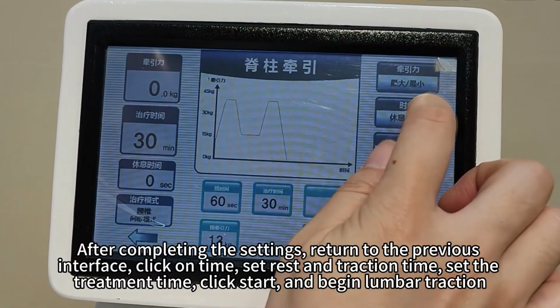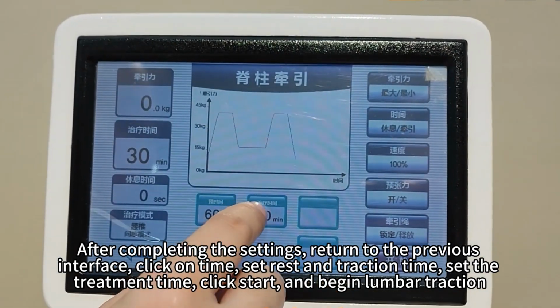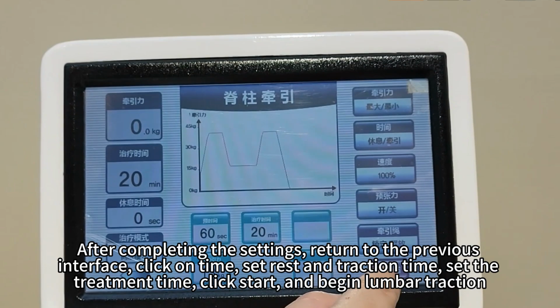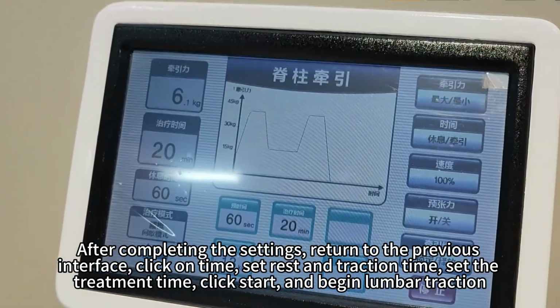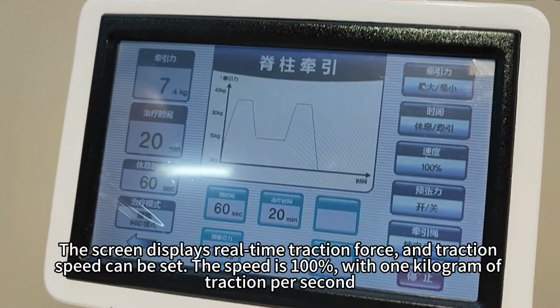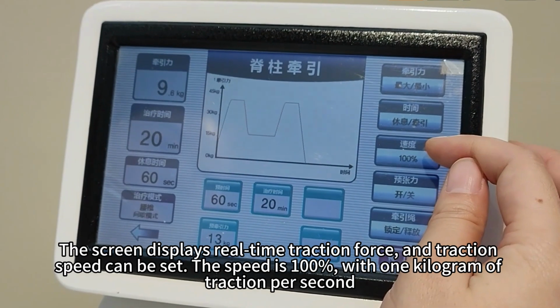After completing the settings, return to the previous interface. Click on Time. Set rest and traction time. Set the treatment time. Click Start and begin lumbar traction. The screen displays real-time traction force, and traction speed can be set.